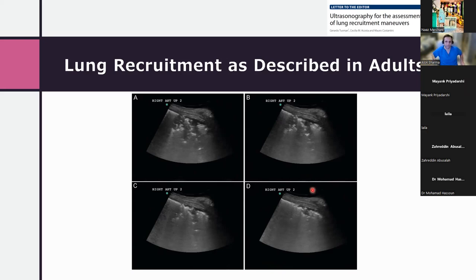Please. Yeah, I would also look at the response to FiO2 going up or down, and at the blood pressures as well as the signs of perfusion. And in our unit, we typically do not go beyond a PEEP of 15 in preterms and 17 in terms. Yep, you would not go beyond 15. So definitely the clinical condition would predominate over the fixed number. If the baby becomes unstable or the perfusion is not okay and the saturation is not improving, we would not increase the MAP.